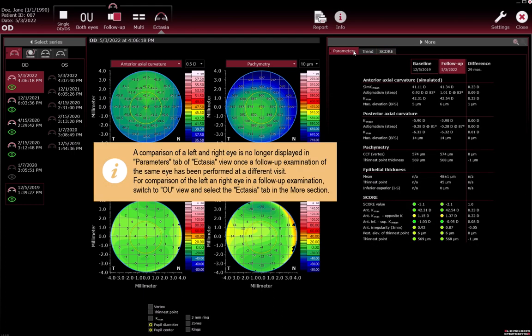A comparison of left and right eye is no longer displayed in the Parameters tab of the Ectasia view once a follow-up examination of the same eye has been performed at a different visit. For comparison of left and right eye in a follow-up examination, switch to the OU view and select the Ectasia tab in the More section.